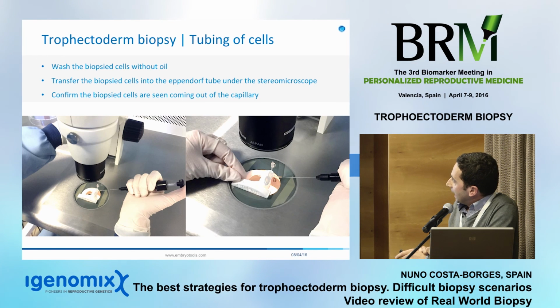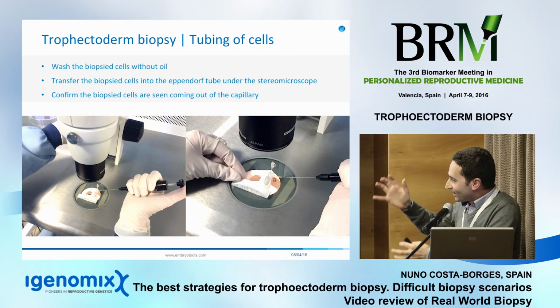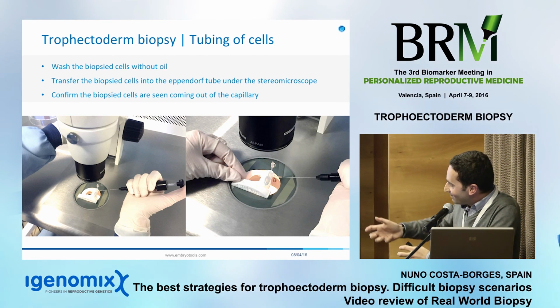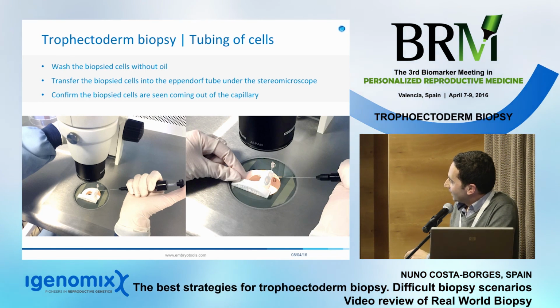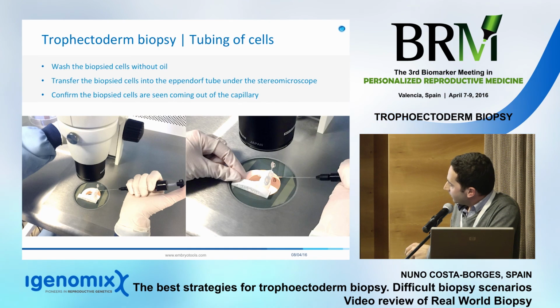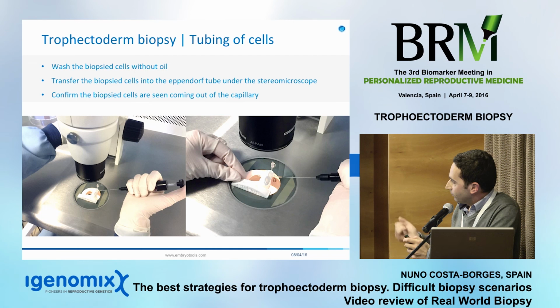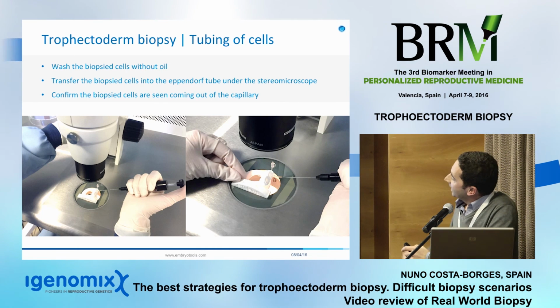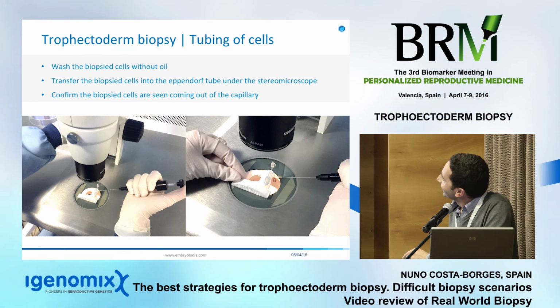And this is a small adapter that we developed because we were always feeling that we didn't have enough hands to do all these things and focus the Eppendorf, and maybe shaking because we were nervous at the moment of doing the tubing. So we developed this adapter that holds the Eppendorf tube and allows us to have a hand free, so we are able to focus the Eppendorf at the same time that we transfer the cells. And this helps us very much. We are completely addicted to this small device.